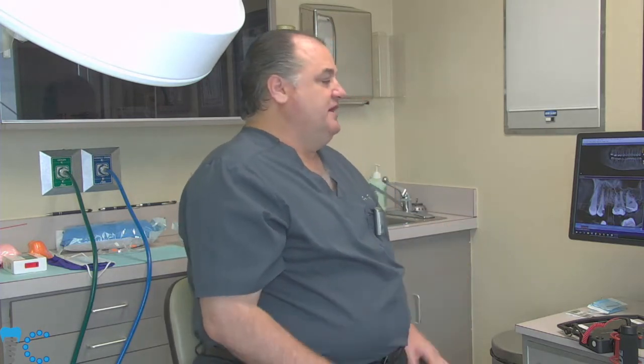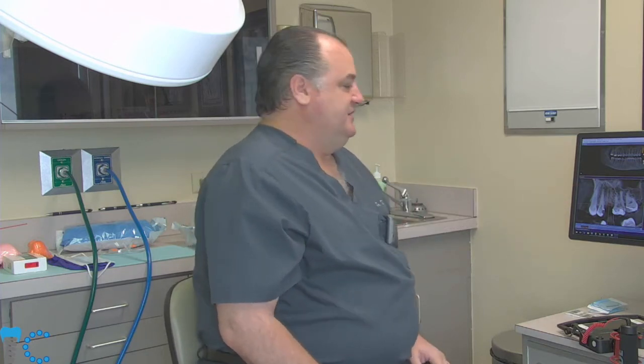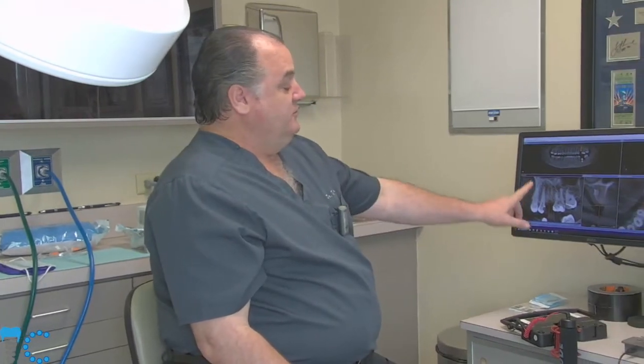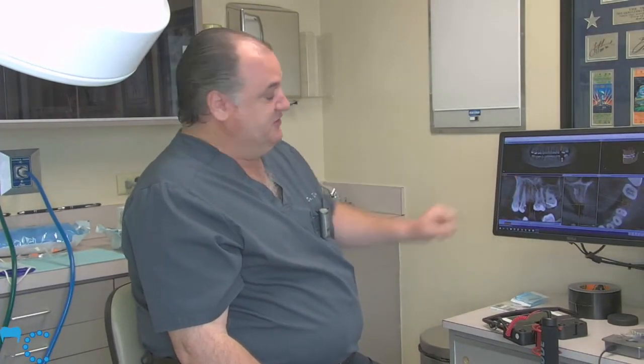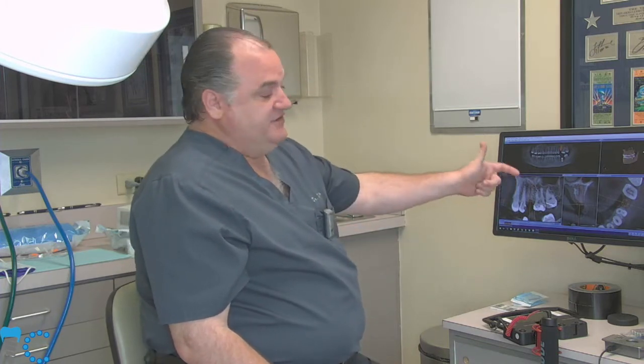Or we could do a guided surgery where we use any manufacturer's surgical guide that we want, typically a keyless surgery drill kit, and we will use the surgical guide to drill through for our osteotomy, and we'll go all the way to the very last drill.